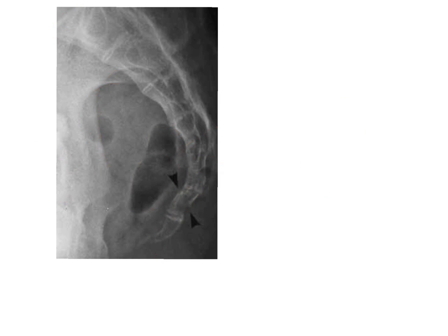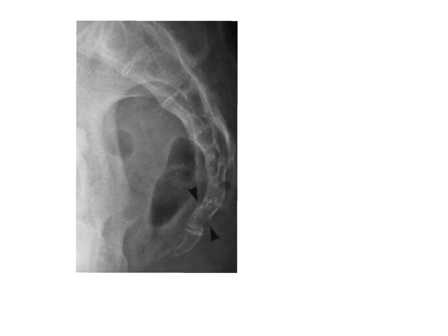Okay? So what do we really want to see? Well, we talked about seeing the L5-S1 joint, the sacrum, the coccyx. We also want to see the median sacral crest in profile. Not much else to know other than this is a difficult area to penetrate. There's a lot of tissue, a lot of bone, there's gas, so it is really important that you collimate properly to reduce scatter secondary radiation, which ultimately helps reduce patient dose, because you have to remember you're putting a lot of radiation near sensitive areas of the body.